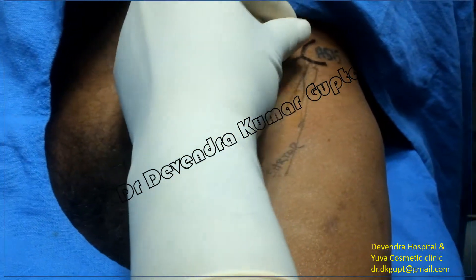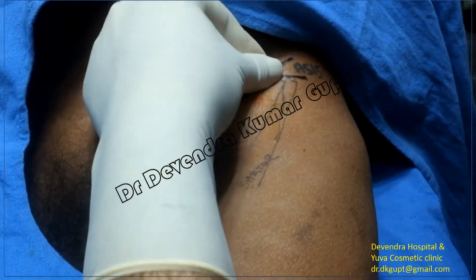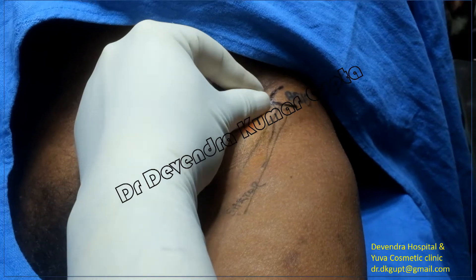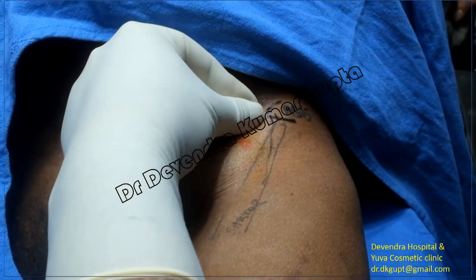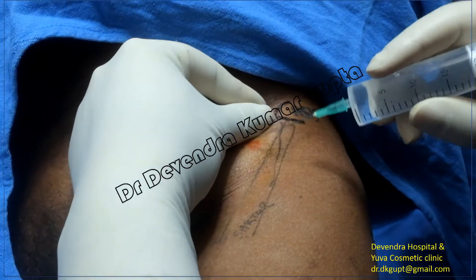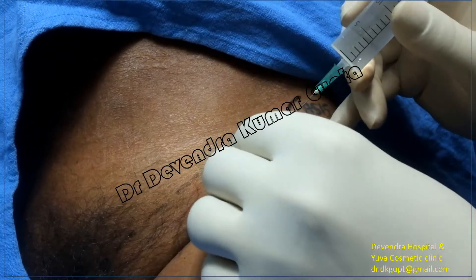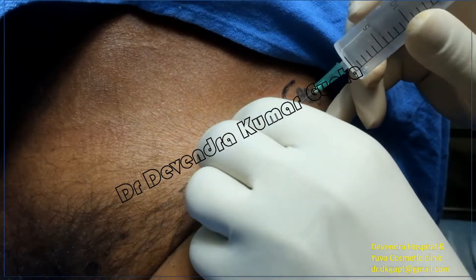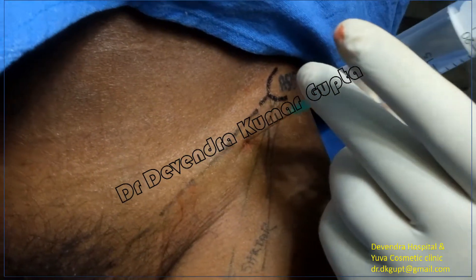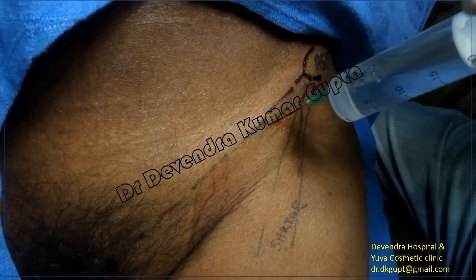The easy way to identify the entry point for the fascia iliaca compartment block is to catch hold of the anterior superior iliac spine with the thumb and index finger of the non-dominant left hand. The interphalangeal joint of the thumb represents the entry point of the needle.